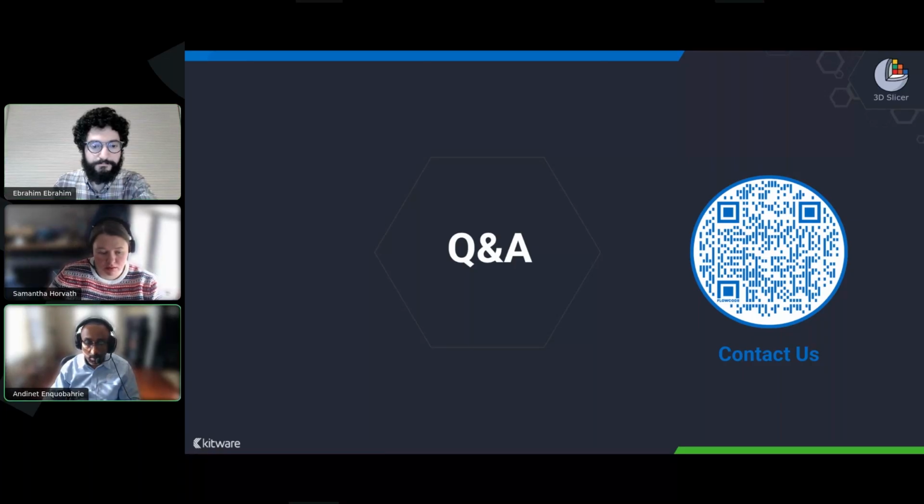Okay, thank you. A question for you, Sam. If people want to be involved in the community, contributing bug fixes and PRs, what would be the right way to do this? So the first steps to getting involved in the community are checking out the GitHub repo. And I know that we have some issues on the GitHub repo tagged as good first issue or good things to tackle for newer developers.